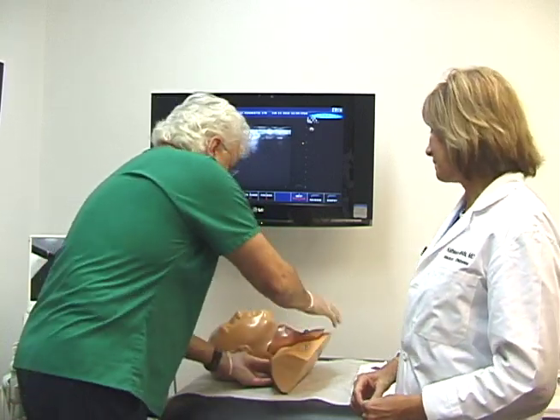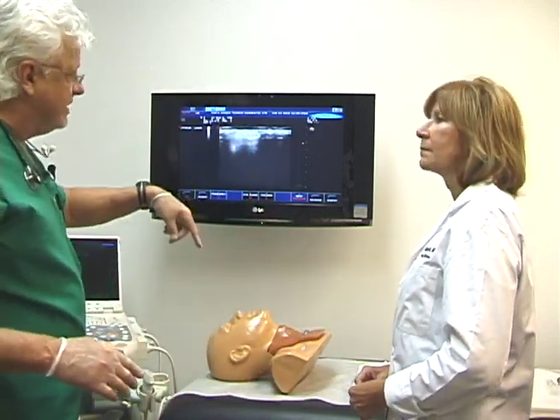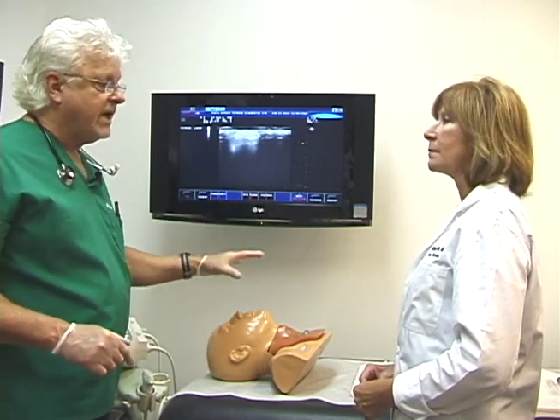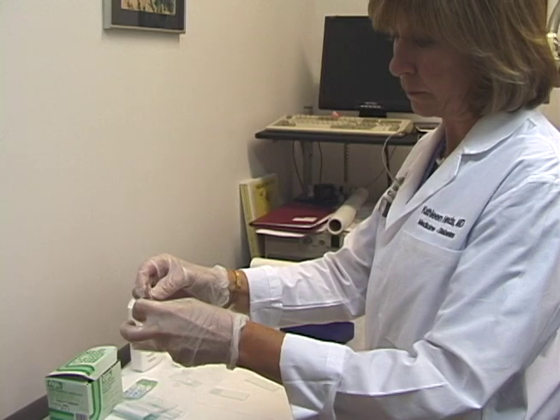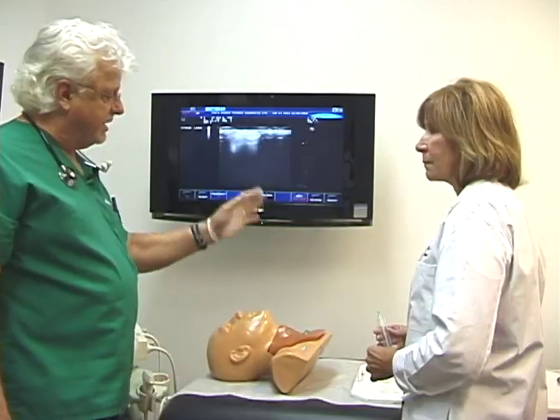We're going to lay him down. You're going to ultrasound his neck, and then you're going to place the needle in. All you're going to do is placement, because this is not designed for any aspiration — just to show that you have the ability to put the needle where you want. Then you're going to make some smears, so you'll have ultrasound, needle placement, and smears.